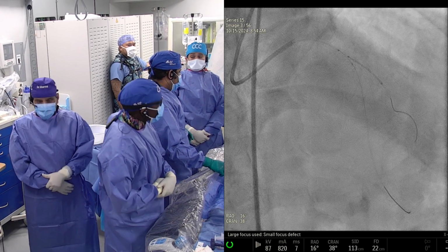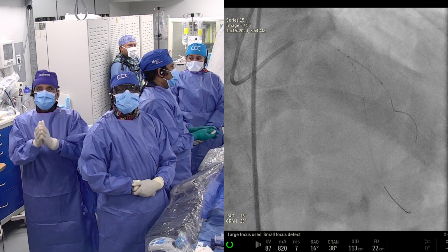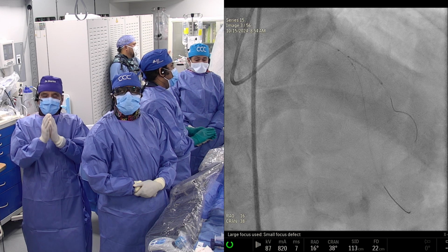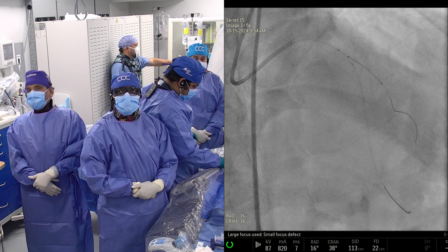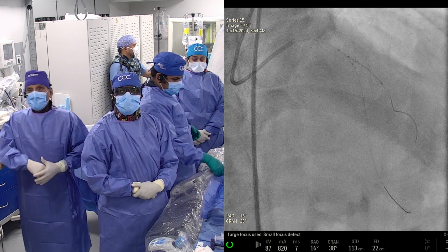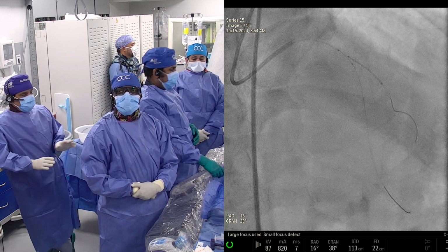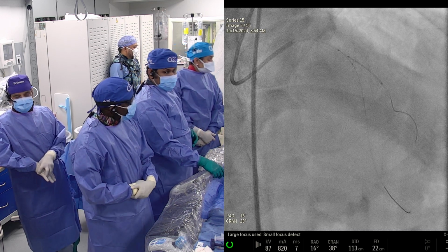The CTOs were not part of it. So the question is, what are your FFR measurements in this acute situation when there is catecholamine, there is vasospasm, the FFR could be falsely negative. Right. So that's basically I would say the only answer, in the MI setting versus the stable setting of the FAME. Exactly right. Yeah, completely agree with that.